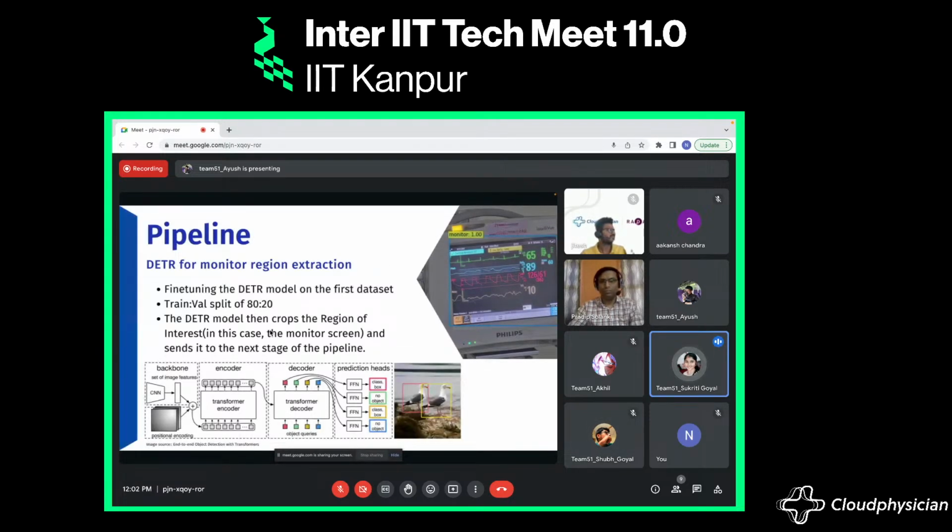The pipeline is divided into three stages. In stage one, we applied the DETR model fine-tuned on the step one dataset that was provided for monitor detection. Once the monitor was detected, we cropped out the monitor from the original image. In stage two, we used the DETR model fine-tuned on the classification dataset for vitals detection and classification.